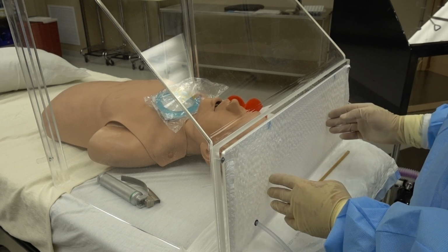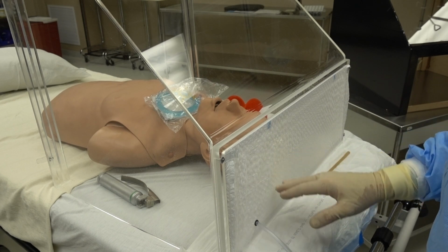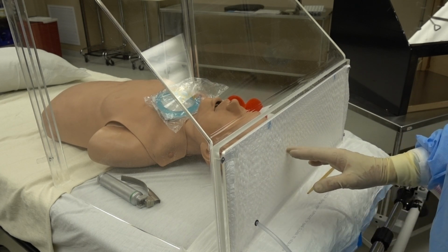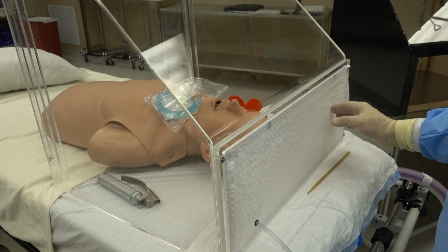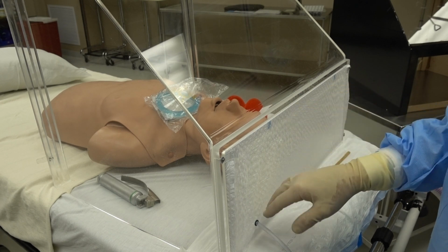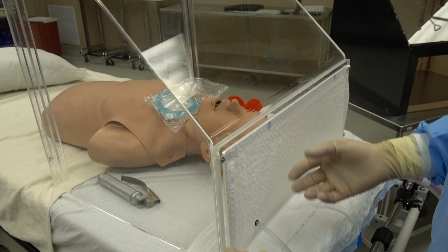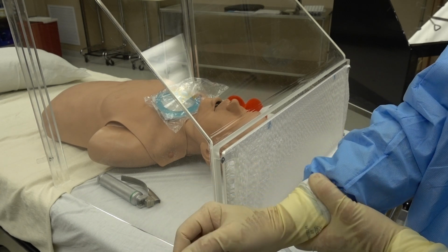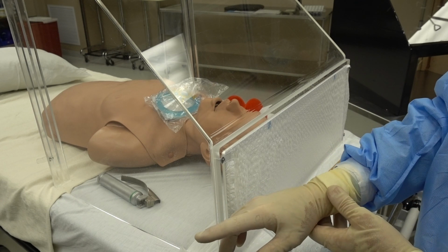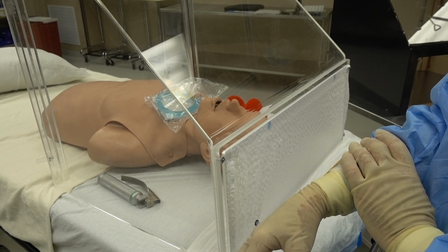and they're fixed in a certain position. I believe they're about 10 inches off the bed. This one, you can put your ports wherever you want. So if you like it high or low, but you can't go over about 10 inches from here to here. And you need to put your arms clear in. You need to make sure that you tape around your wrist when your gloves or your gown, because this will be so tight it will literally take your gloves off, or it'll roll your gown up when you go in.